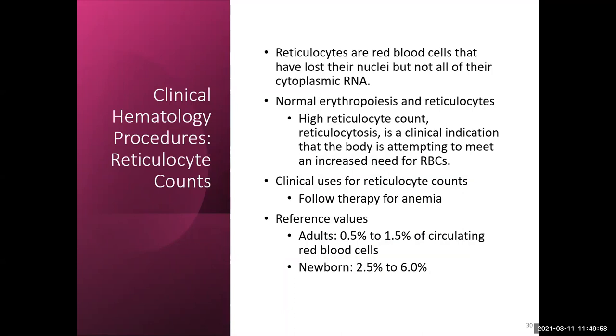Your reticulocyte count, you'll also get an opportunity to do this manually in hematology. So again, those reticulocytes, we're looking for the cells that have that RNA left inside of them. They have gotten rid of the nucleus.